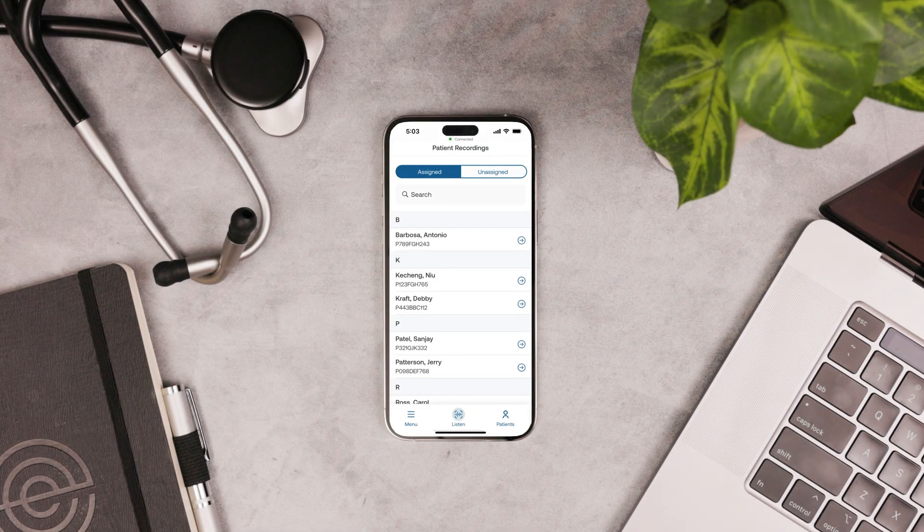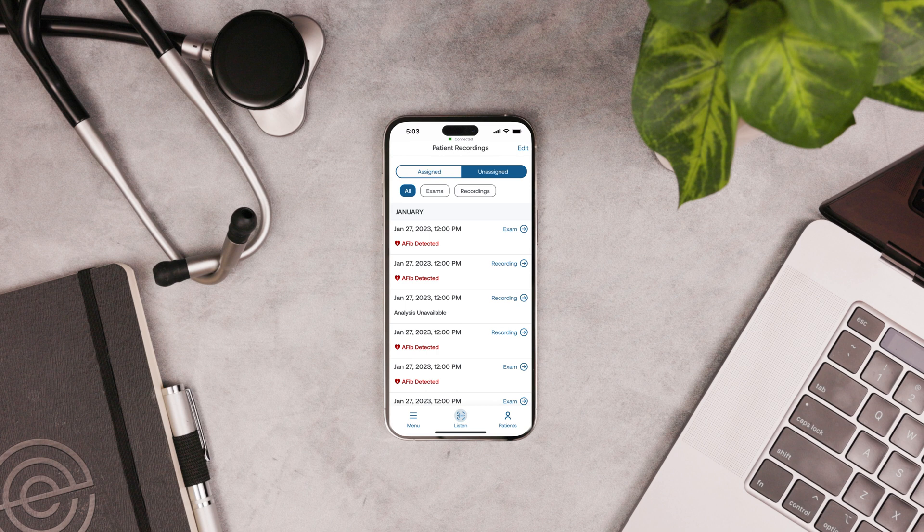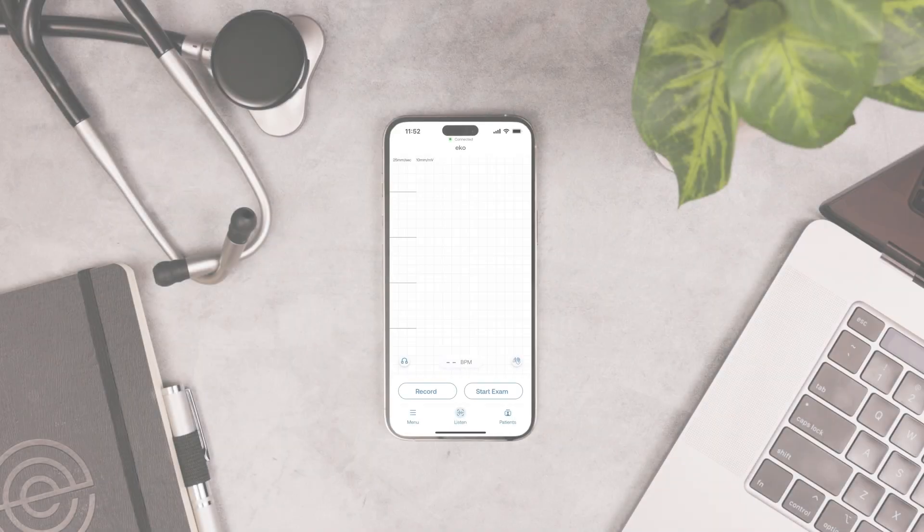On the patient screen, you can manage your patients and playback recordings. You can navigate between assigned and unassigned recordings.